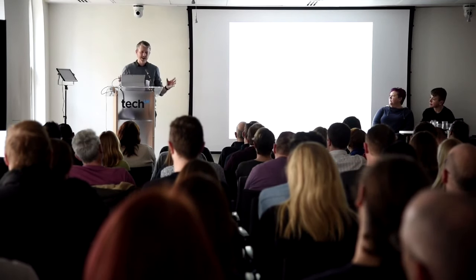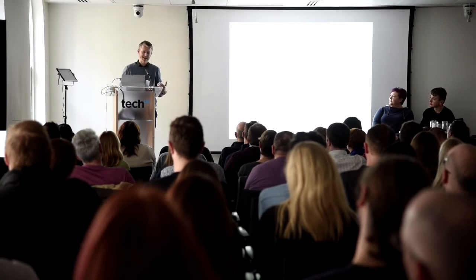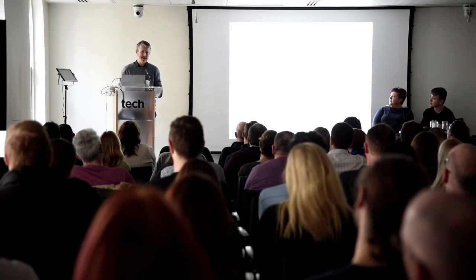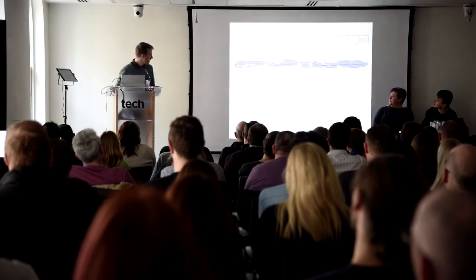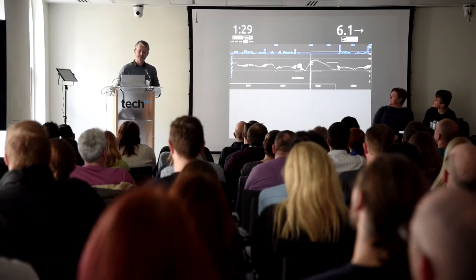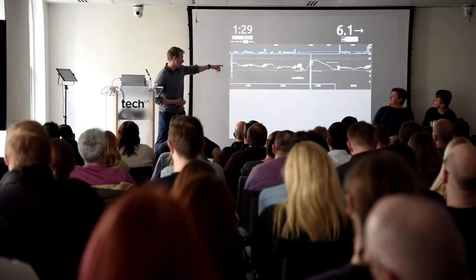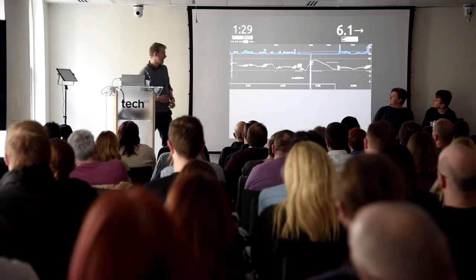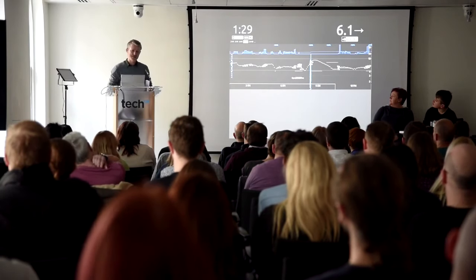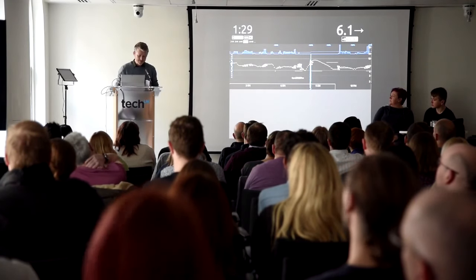It would be easy to say this is great. What I should actually do is just take a picture of what my control has been like today with minimal input from me and show you what it looks like. This is 12 hours up to lunchtime, so I left this as late today as I could before taking the screen grab. But you can see that's just over 4 and that's 10 up there. So you can see, really without me trying very hard, the system has achieved a great result.